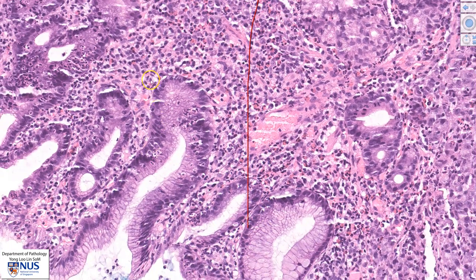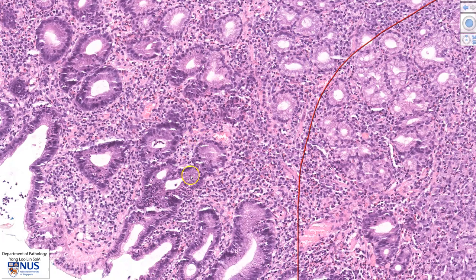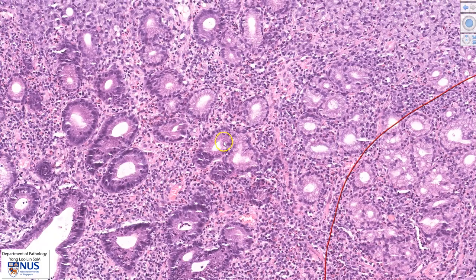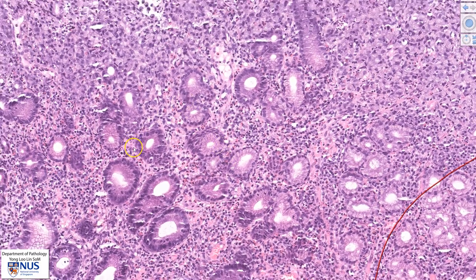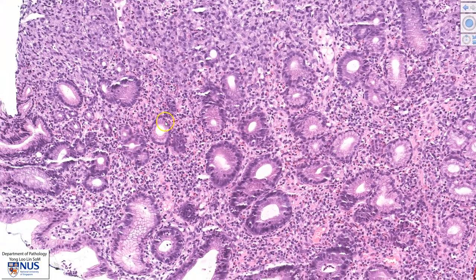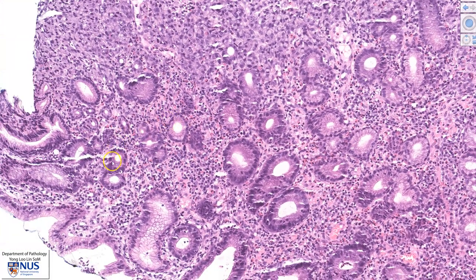The presence of neutrophils within the gastric epithelium indicates that there is active inflammation. Hence, there is a background of active chronic gastritis. Looking around in the gastric glands in this area, we do not see evidence of intestinal metaplasia, which would appear as goblet cells among the gastric epithelium.